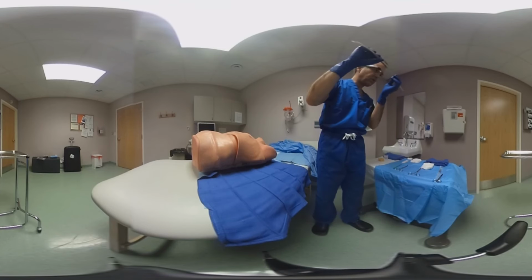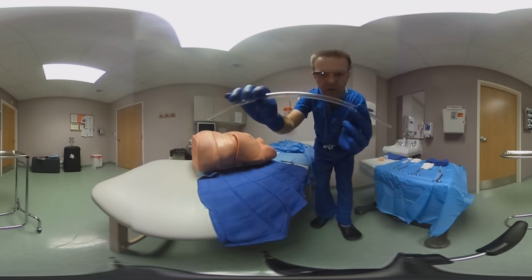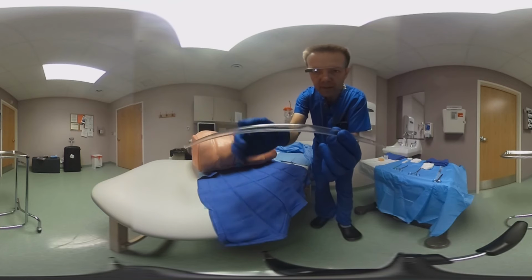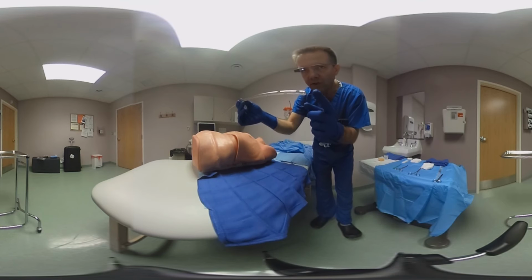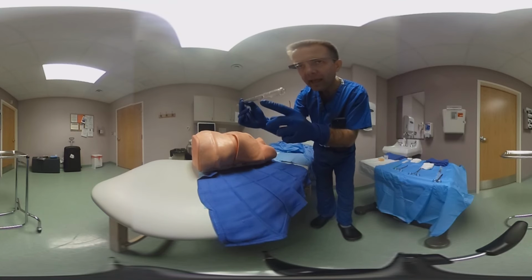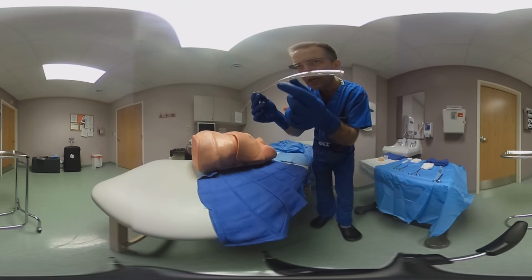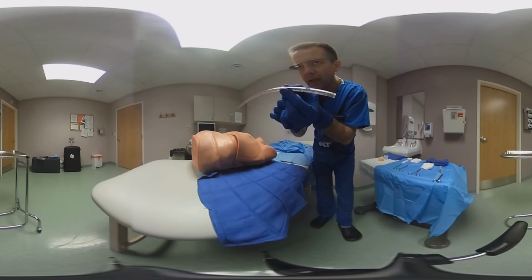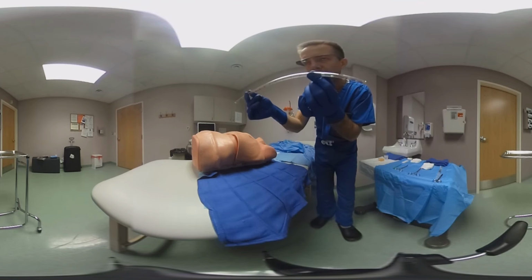The indications of the procedure I'm going to obviate, but this is a chest tube, and as you can see, a chest tube has numbers on it, and the numbers are a way to measure where the tube is. The numbers don't start at the tip, the numbers start at the last hole. It has holes on the side, and that last hole needs to be inside the pleural cavity. Otherwise, you will end up getting a persistent air leak. The numbers start at the last hole up to the beginning of the tube.